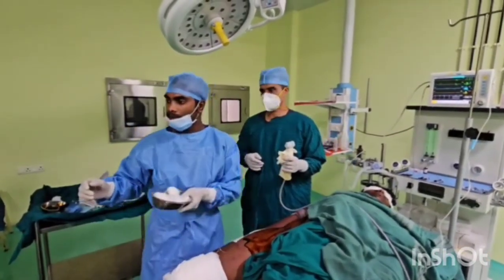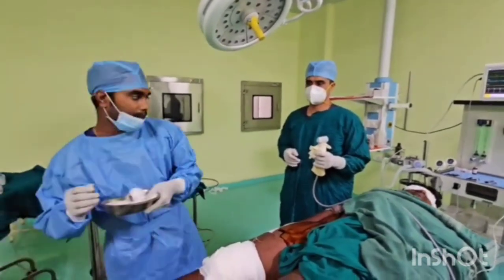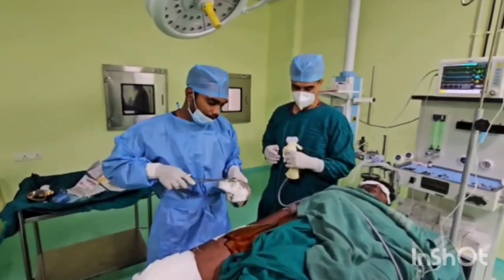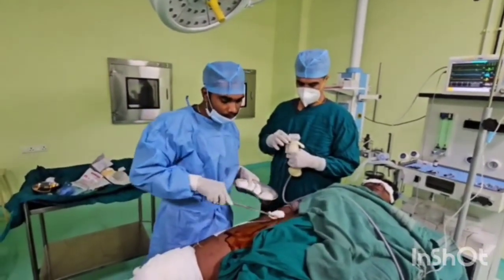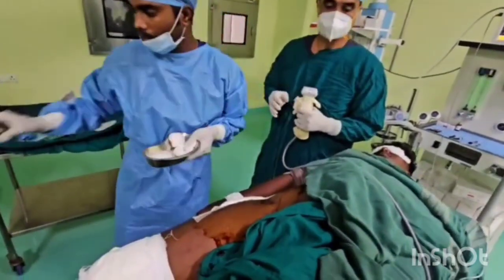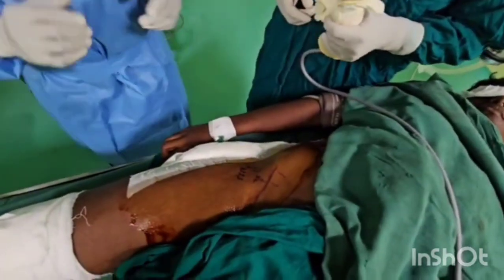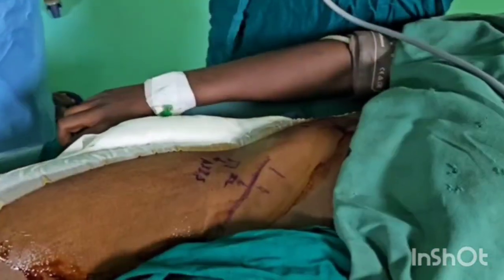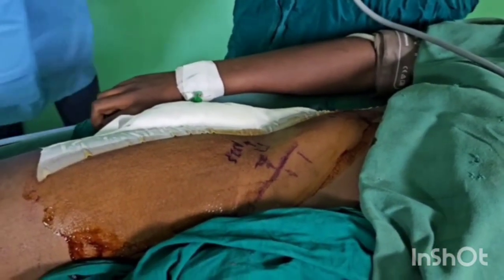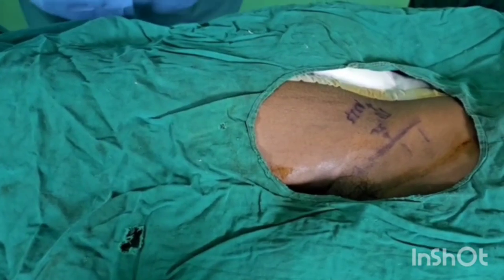Post surgery, he has been subjected to suprainguinal fascia iliaca block under ultrasound guidance. So, under aseptic precautions, parts painted and draped, and the SonoSite ultrasound has been kept ready. So, marking the following landmarks. Now, we will see the picture in the ultrasound.